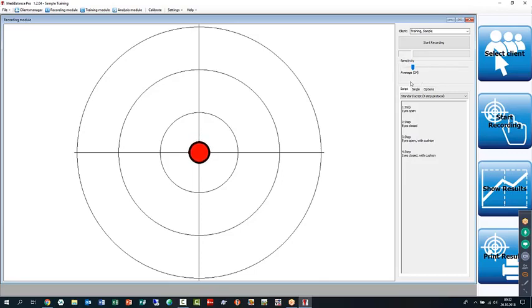You leave the sensitivity level, which is up here, to 24 average. You can change it for specific analysis to highly low sensitivity. So if you have somebody who weighs 200 kilogram, you want it less sensitive. Or if you want to do hand training with it, you put the platform on the table and you place the hand on it.